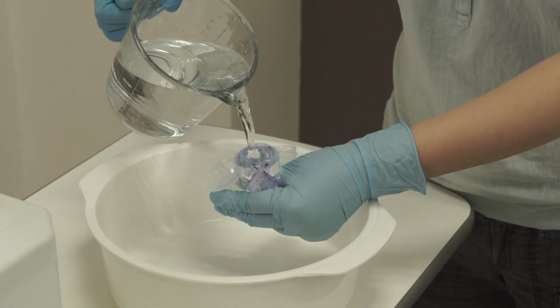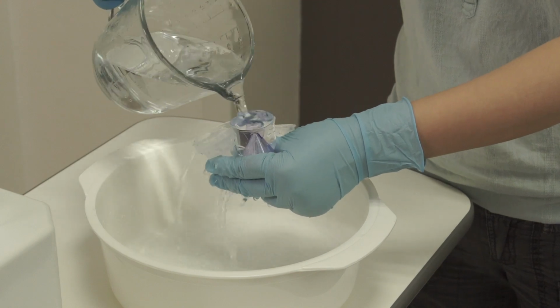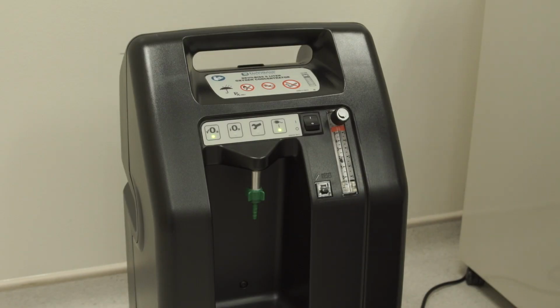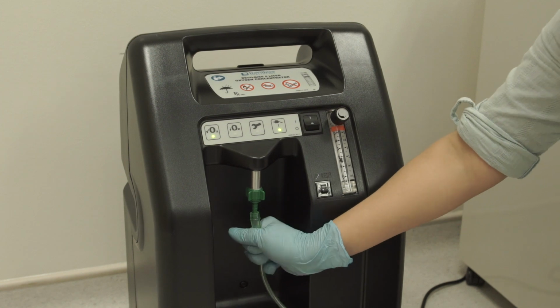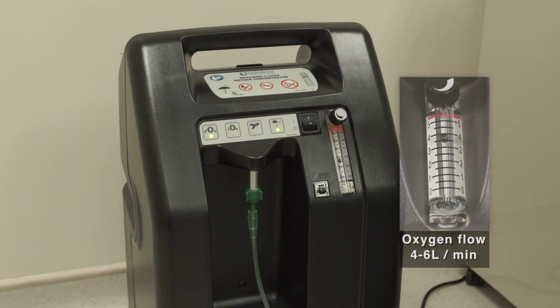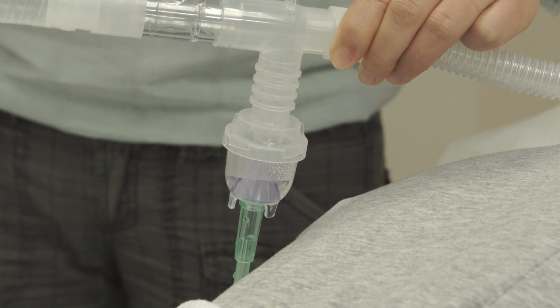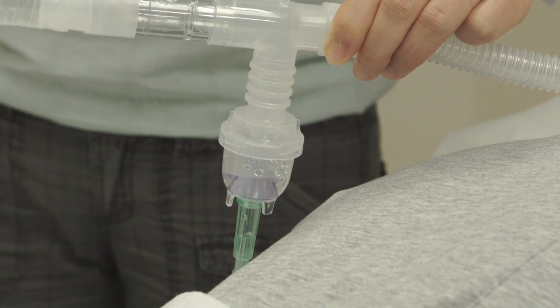Rinse the chamber with cool boiled water, then air dry and keep it in a container. You can also use oxygen concentrator to nebulize medication. Connect the nebulizer tube to the oxygen concentrator. Set oxygen flow at 4 to 6 liters per minute. Oxygen will drive the liquid into tiny water droplets.